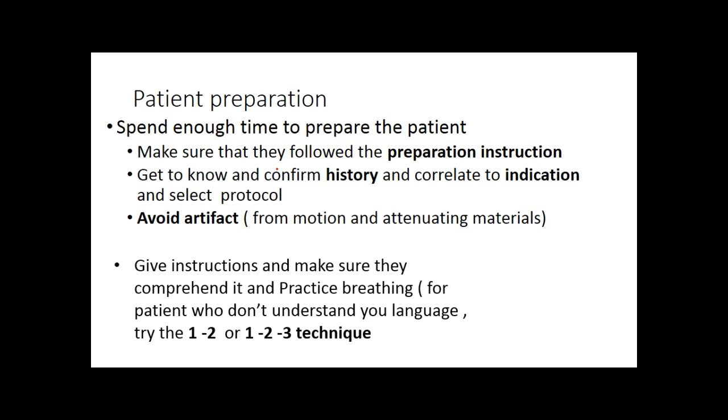Breathing instructions are also given to the patient in the beginning and just before you start the examination. One of the problems with breathing instructions is that we think the patient understands what we are saying. The best way is to practice it in front of them, to show them how it is done and how deep it is done. If the patient doesn't speak your language, you can use the 1-2 or 1-2-3 technique.